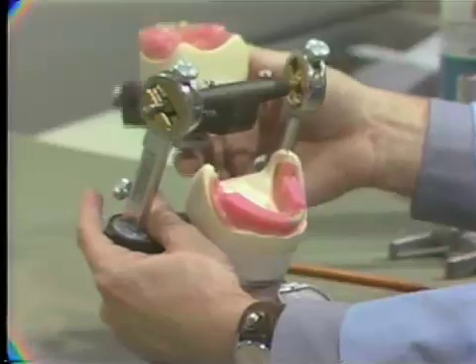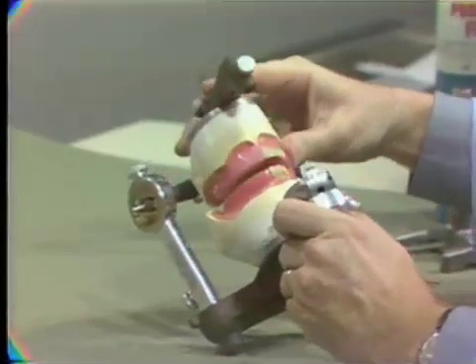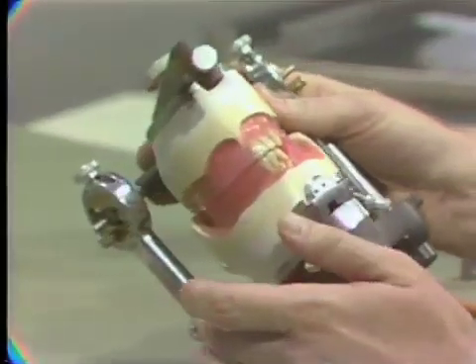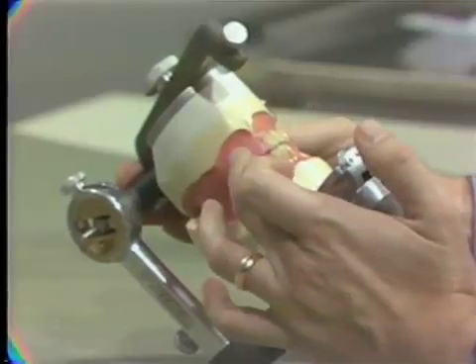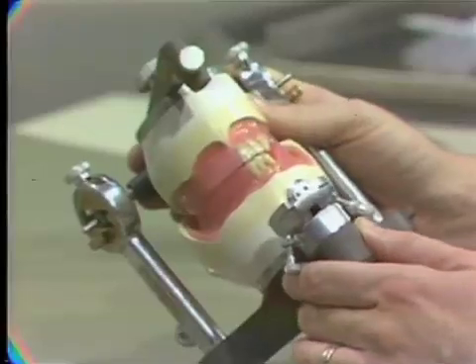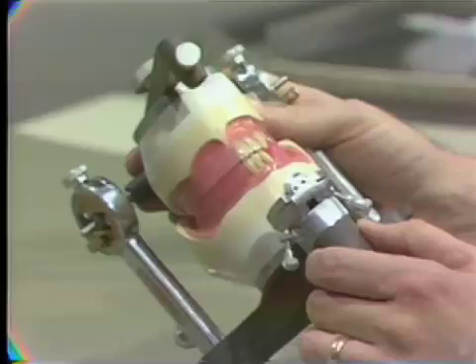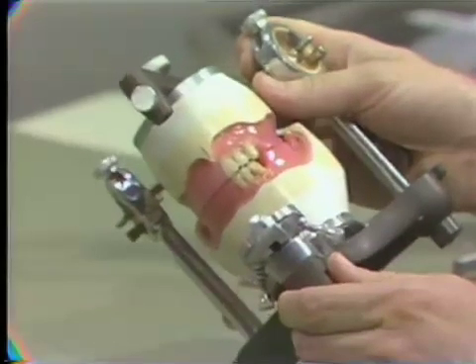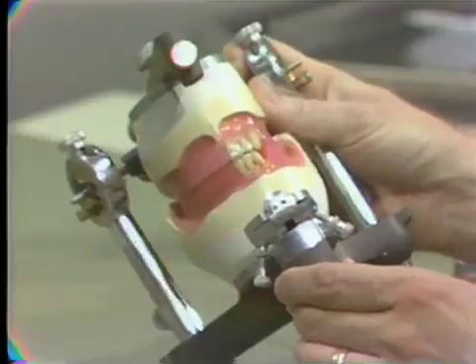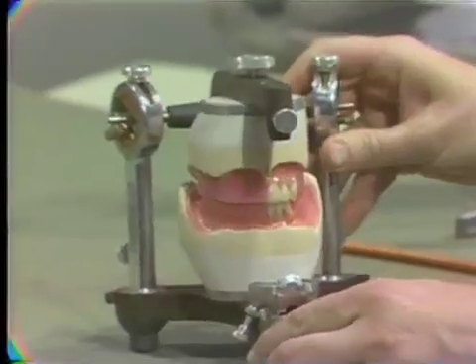At this time, to complete the anterior setup, once we are satisfied with the arrangement of these 6 teeth, we simply go to the other side and, starting by removing the wax on the upper, go through the same procedure that we have just demonstrated and complete the anterior setup, all 12 teeth. And at that point, when everything is in order and you're satisfied that you have them set correctly, not until that time will we set the posterior teeth. So this completes the setting of the anterior teeth for the complete denture.